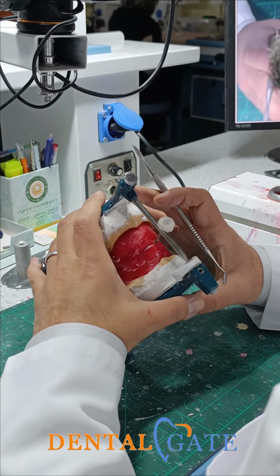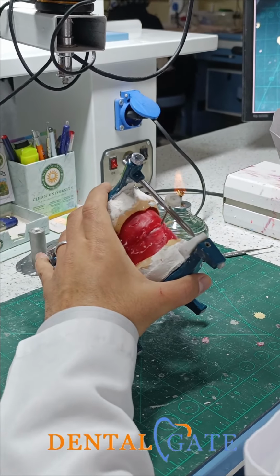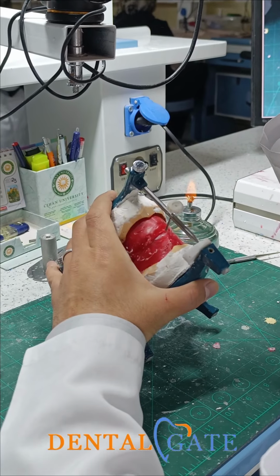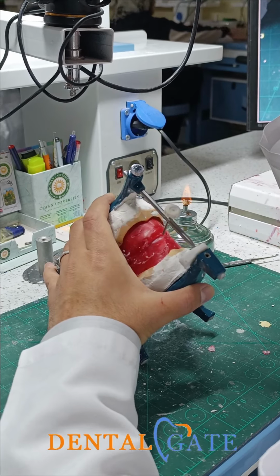In accordance to the relationship registrations, we will transfer this relation to the articulator. If we have a patient, we must make an index within the bite inside the patient's mouth.